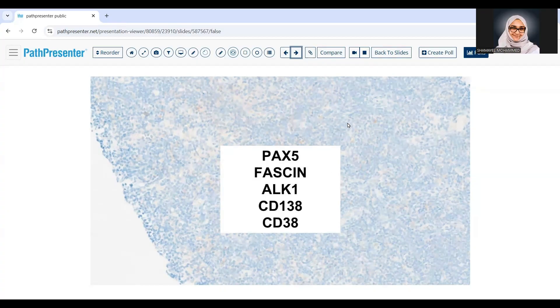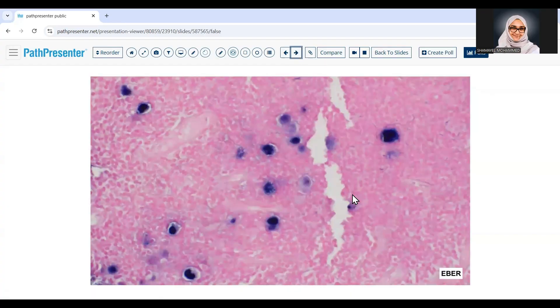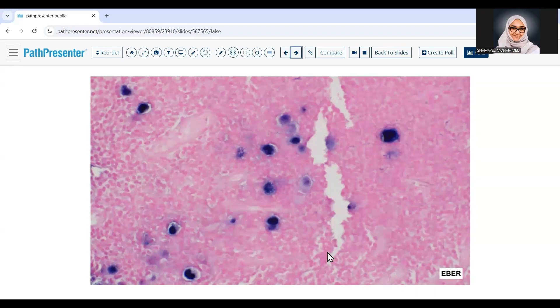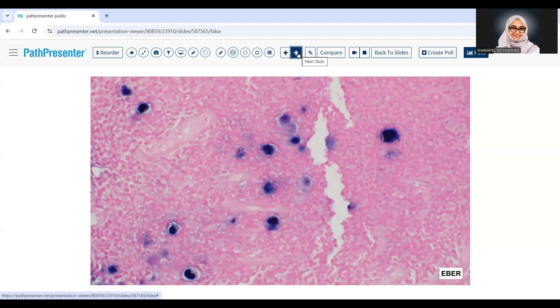With Hodgkin lymphoma becoming less likely, we started thinking it could be something else. All the T-cell markers performed — CD43, CD5, CD4, CD2, CD7 — were also negative. So additional markers were performed, and EBER was positive. We now had atypical lymphoid cells with immunoblastic/Hodgkin-like morphology showing CD30 and EBER positivity, but negative CD45, CD20, CD3, CD15, Fascin, and ALK.